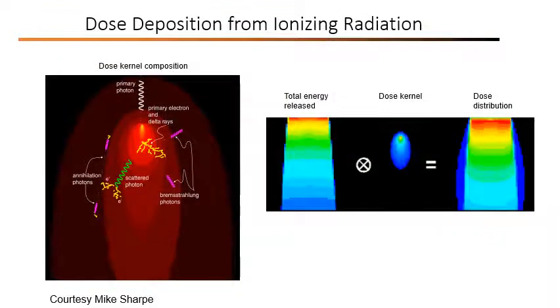One of the issues with MRI linear accelerator integration is the effect of the MRI on the dose delivered to the patient. Dose is delivered not by the photons themselves, but by the electrons that are created by the high-energy photon beam. These electrons are scattered in the patient, and since the patient is placed in a strong magnetic field, the motion of the scattered electrons will be altered by the presence of the magnetic field.